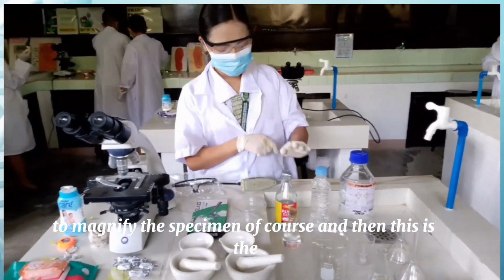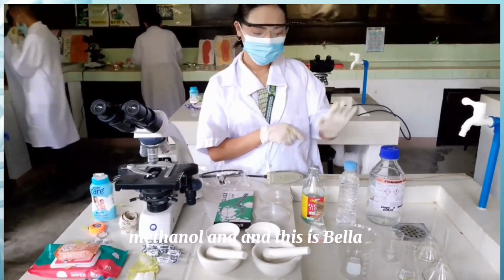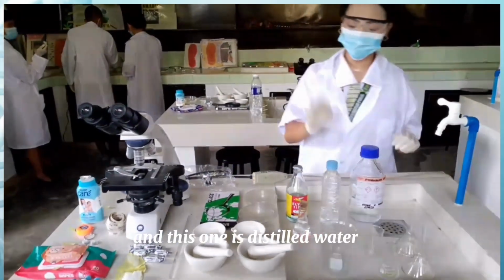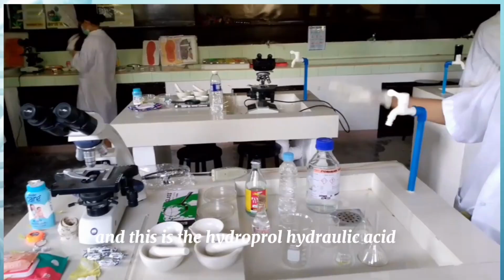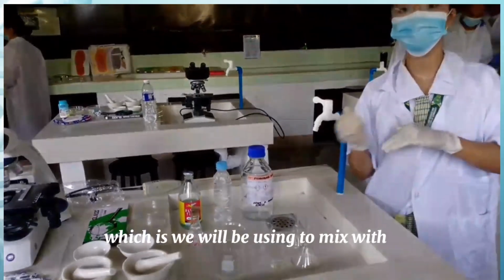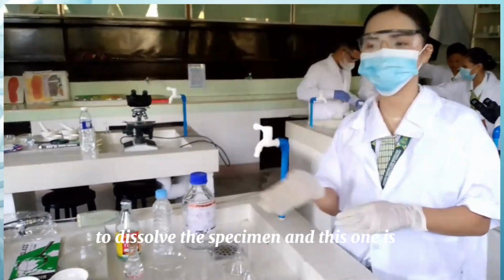And then this is the methanol, and this is the ethanol. And this one is the distilled water, and this is the hydrochloric acid, which we will be using to mix with our specimen, to dissolve the specimen.